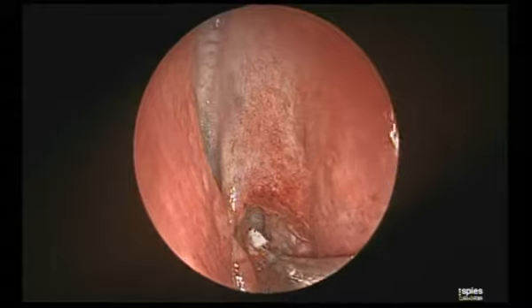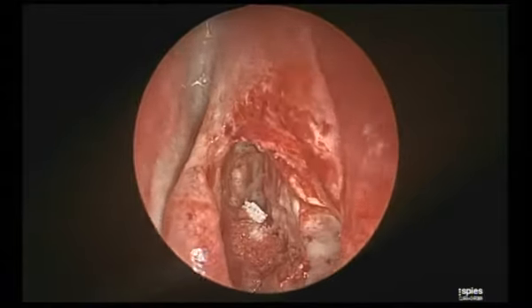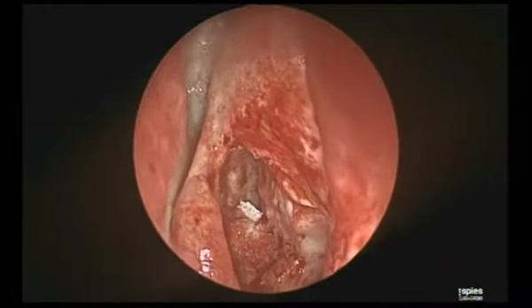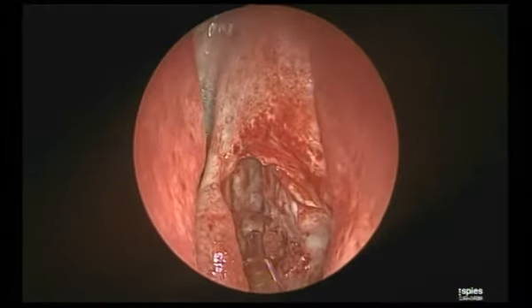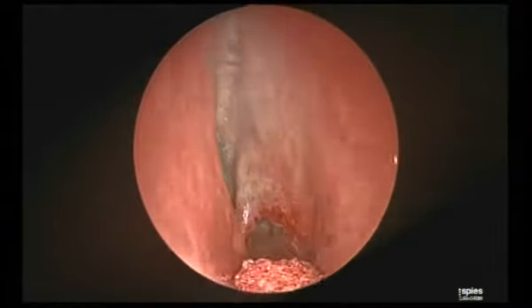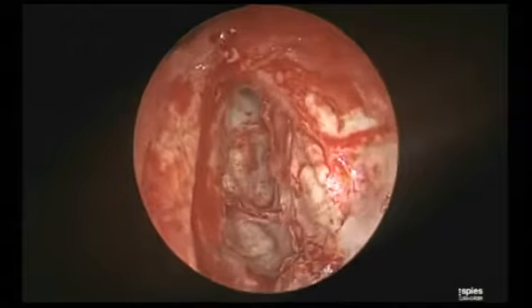I have written to Medtronic twice to change the name of the blade. It has an amazing ability to work at the skull base safely. Adenoids I condemn because it's a posterior facing blade. The first principle of the debrider is to keep the cutting edges in view.